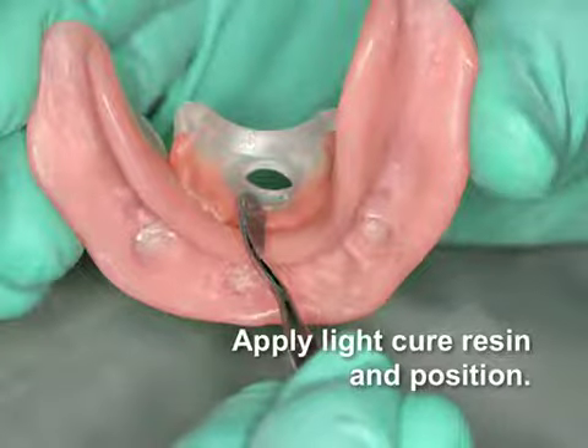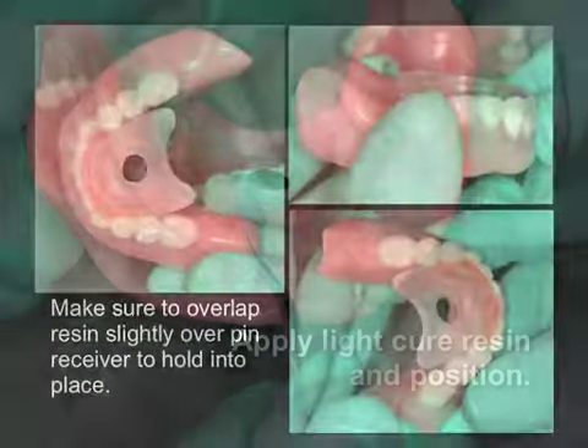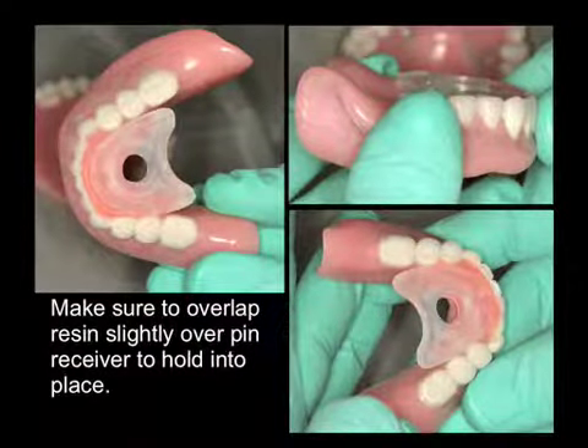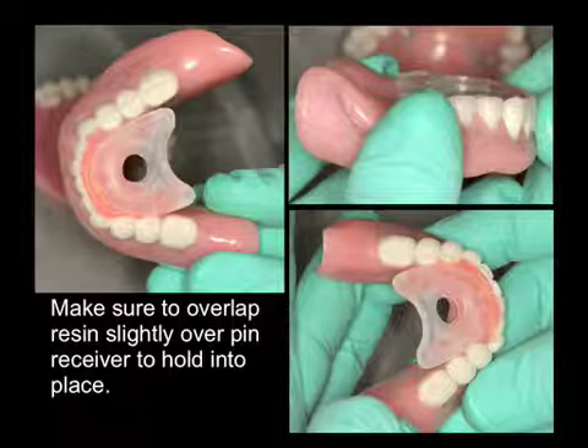We will now apply a light-cured resin between the denture surface and the pin receiver. Once this has been securely inserted, we will make sure a small amount of resin overlaps the top surface of the pin receiver to secure it into place.